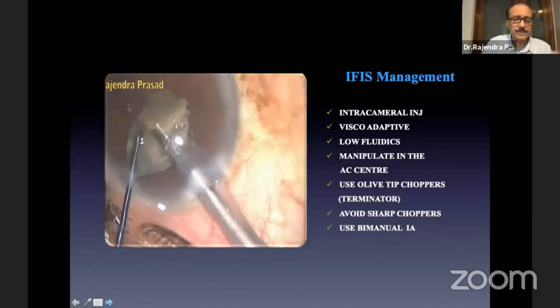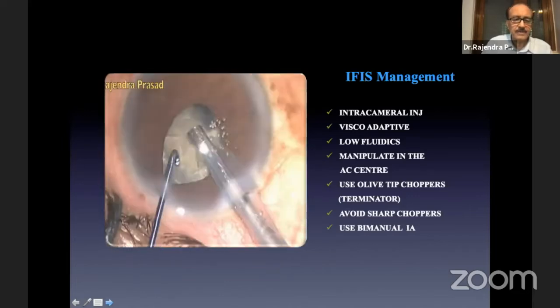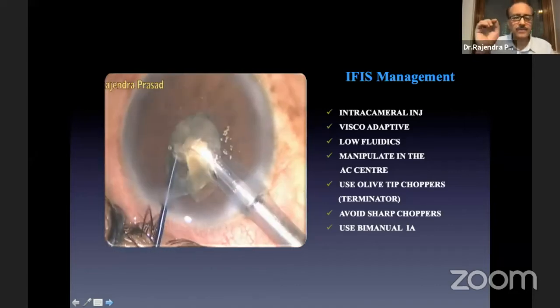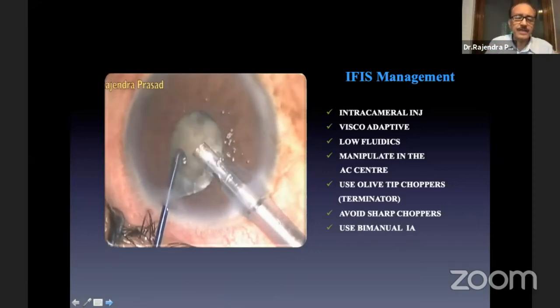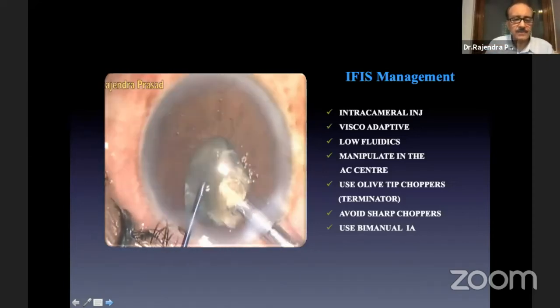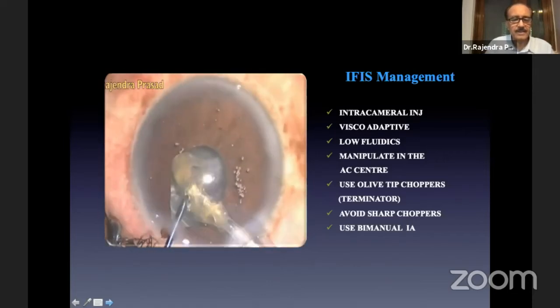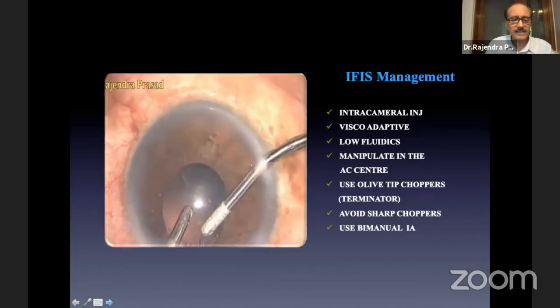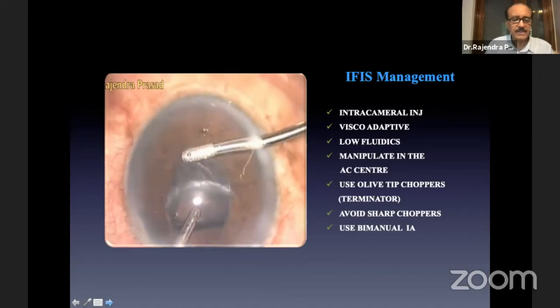And I got one segment out of the capsular bag and was able to emulsify it. The only important point is that your phaco probe, or whatever device you use, has to be at the center of the pupil. Don't touch the iris at any point in time. And so I'm very nicely able to emulsify these nuclear pieces and complete the emulsification.